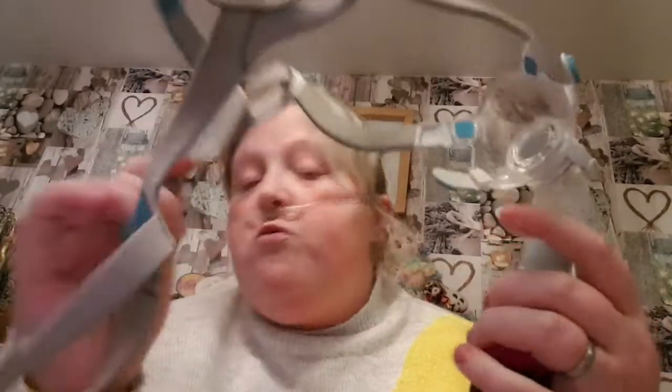This one hasn't got the mask in yet, but it has a lot more freedom here. With this one it doesn't even move, but with this one it completely goes up and down. They are all ResMed, which is the make. I can't remember what this one is.